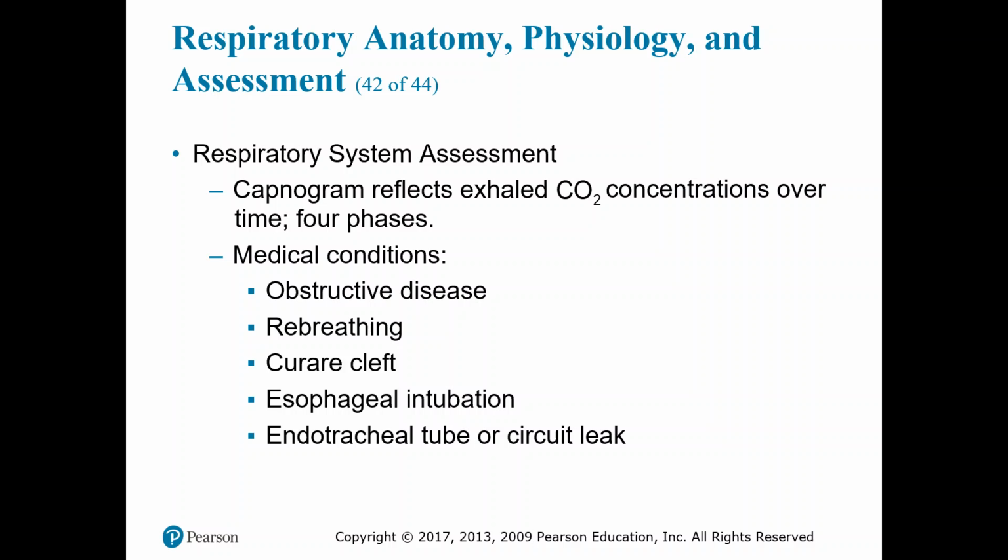Several medical conditions and mechanical ventilation problems can be readily detected by capnography, compared to the normal capnogram. These include obstructive pulmonary diseases such as asthma or COPD, which obstruct air entry and alter the shape of the capnogram. These diseases give the typical shark fin shape to the capnogram. So they kind of look like a shark fin that you would see sticking up out of the water, like in Jaws or whatever.